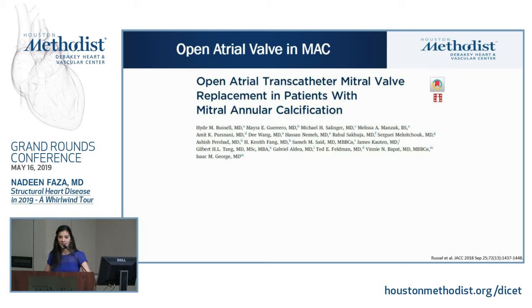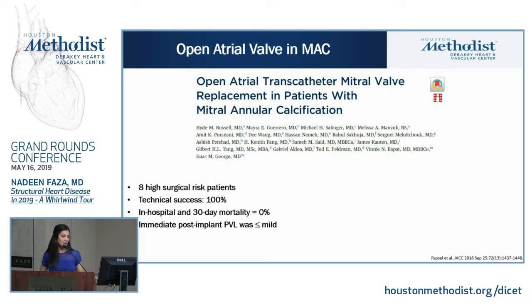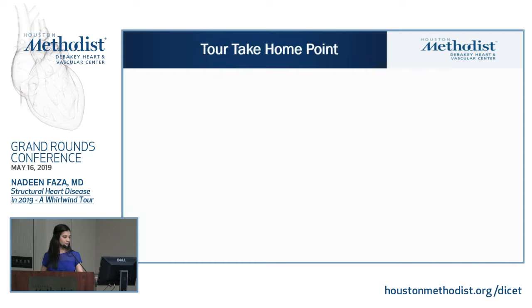paper describing this technique of open atrial valve in MAC with the balloon-expandable SAPIEN 3 device. This included 8 high-risk surgical patients. The technical success was 100%. In-hospital and 30-day mortality was 0%, and the immediate post-implant PVL was less than or equal to mild. So effective, safe, short-term, recently described. But again, patients with MAC are a very challenging population, and hopefully as time goes by, we'll be able to refine all the different procedures and options we have for them.